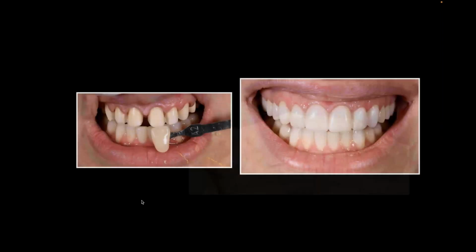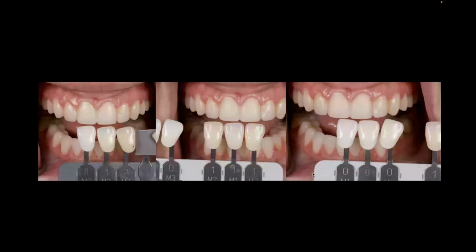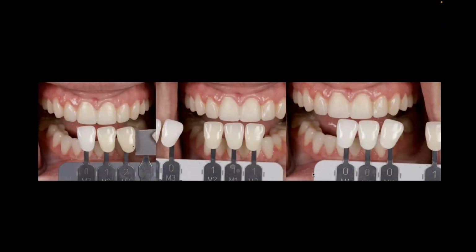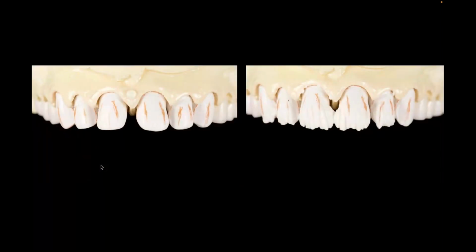So you can see great management here. Provisionalization is done here. Shade is taken, and usually my clinical partners are jotting down what they've done for provisionals, meaning they use bisacryl B1 or whatever color they used. I'd like to see that in the mouth so I have some influence of not only how much color is coming through marginally, but what that coloration looks like against their tissue and in the face. So once that's done, I'll go back to treating this as refractory veneers.